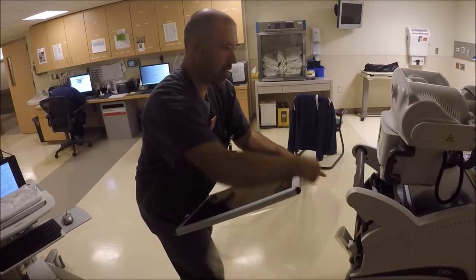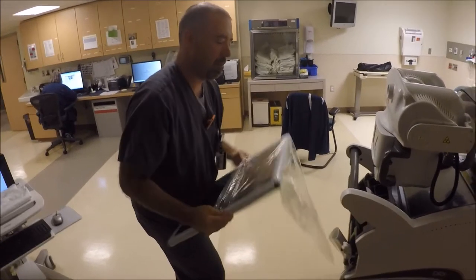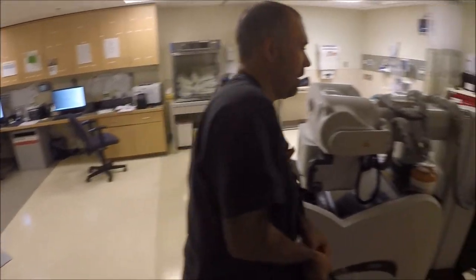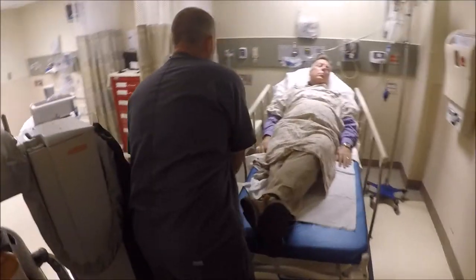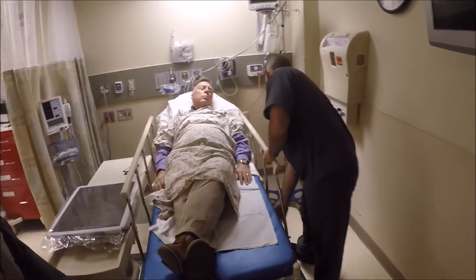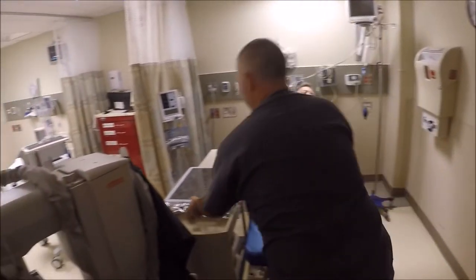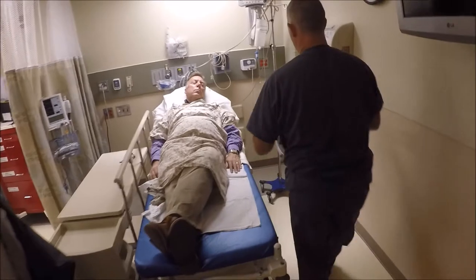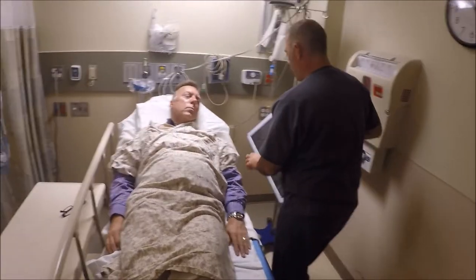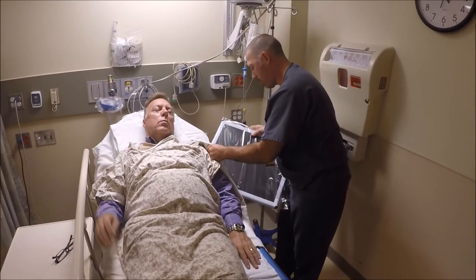I'm just going to put a plastic bag on here. It's just kind of help protect you and the cassette. Makes it go in just a little bit easier here. Set it here on the table while I get your rail down. Like I said, we've got to put this hard X-ray board in behind your back and we'll try to get it as quick and as easy as we can. We've got a nice little pad here so that's above your shoulders.